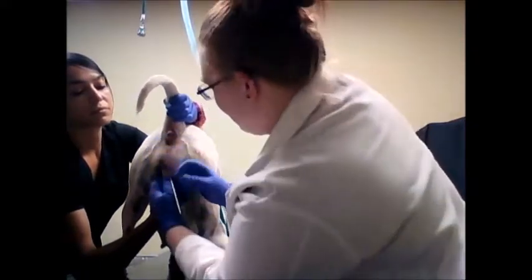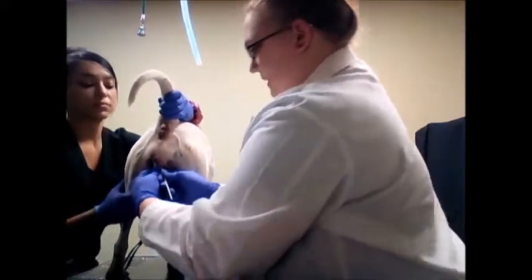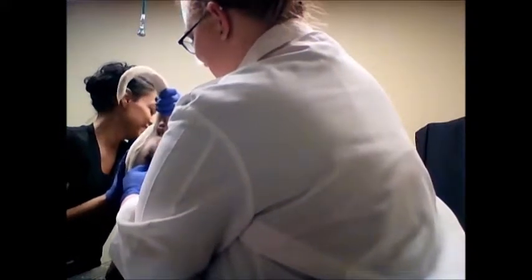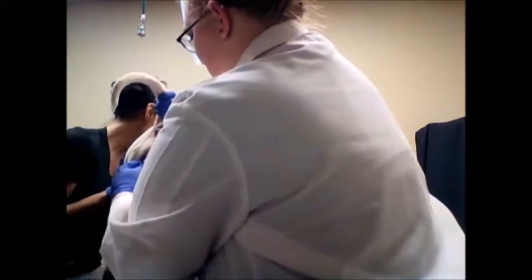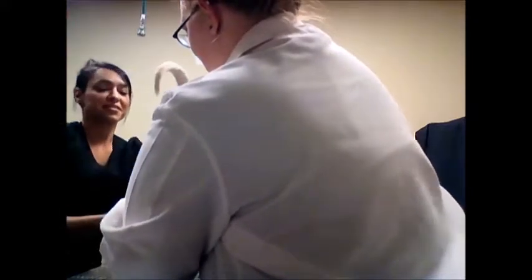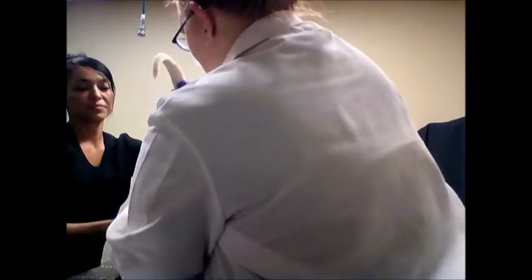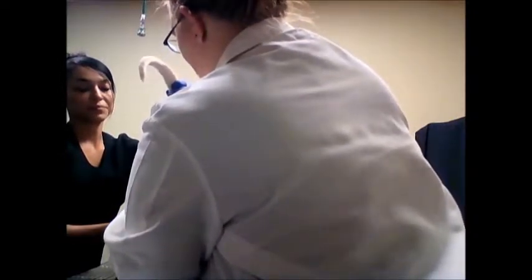Make sure that we get a decent amount up there. Go ahead and roll around in there. Make sure we get a good sample. Open up a little bit. There we go.